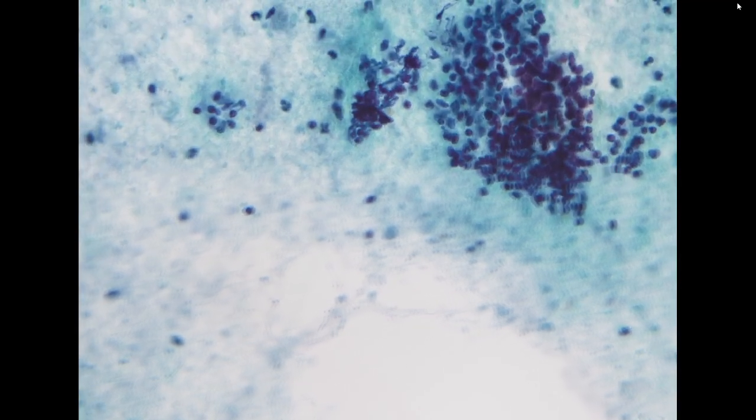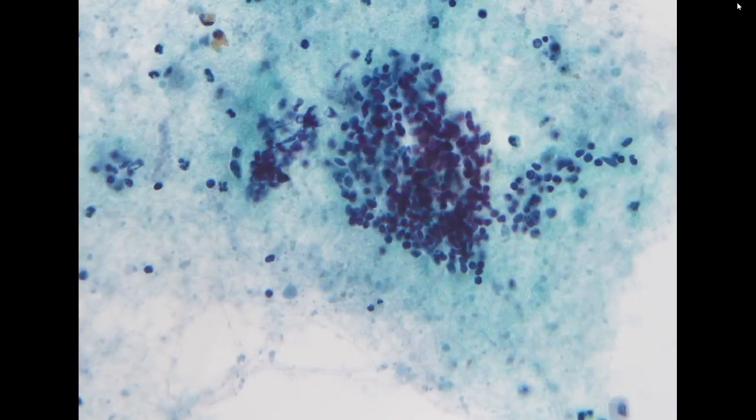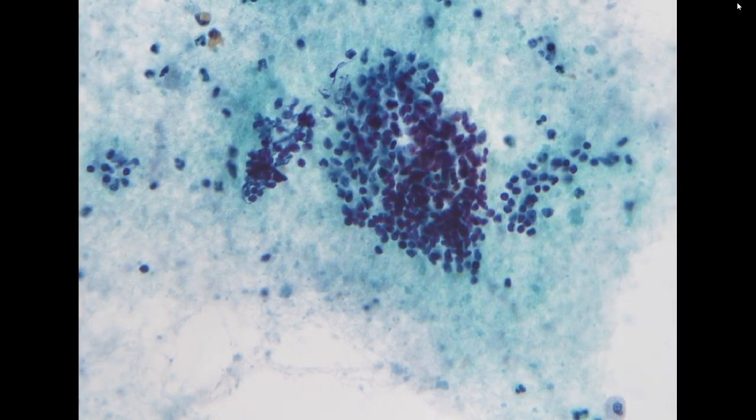So you see the benign oncocytic epithelial cells in large flattened sheets with honeycombing arrangement, and you see this lymphocytic stroma and necrotic cystic debris material. This is diagnostic for Warthin tumor. So this is a benign Warthin tumor, and these two tumor types are the most common tumors that we will encounter in salivary gland aspiration.